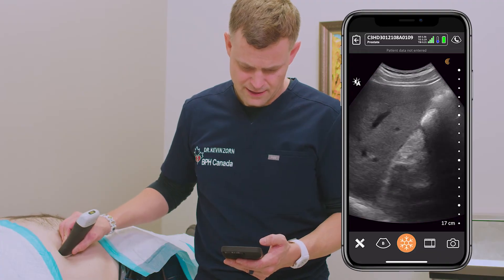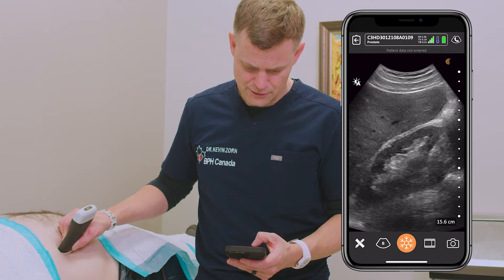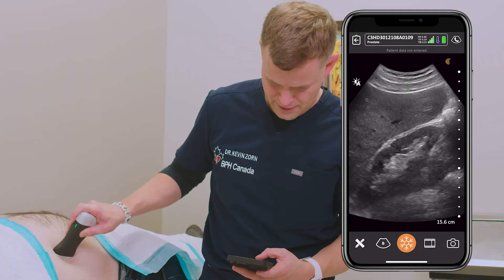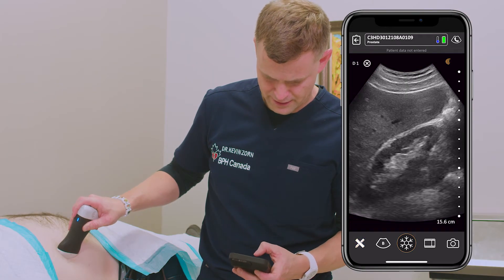So we're trying to see that corticomedullary junction. Zoom in here — there's our kidney. Going to the longitudinal view. Multi-distance.